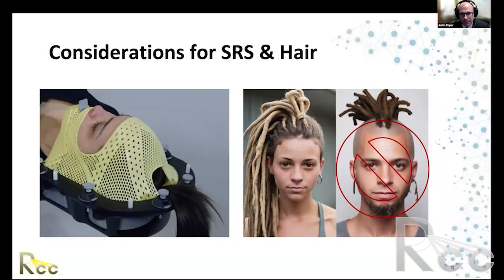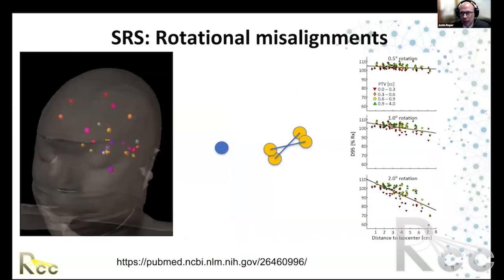Next slide, please. So what about setup uncertainties, and how well do we need to localize the patient for treatment? Well, for whole brain, the fields can be quite large, and small shifts or rotations may not have any real importance in terms of clinical endpoints. However, that's really not the case as we start using more conformal therapies for partial brain, and in particular, very conformal therapies for stereotactic radiosurgery.